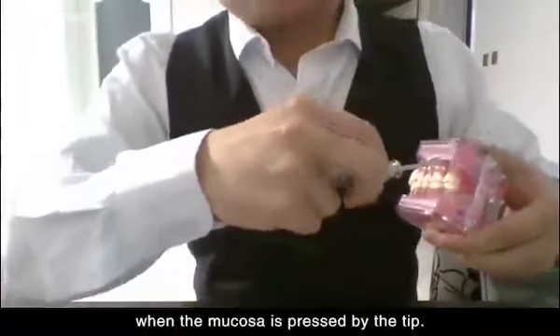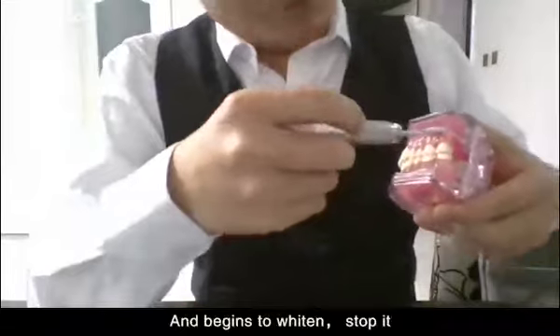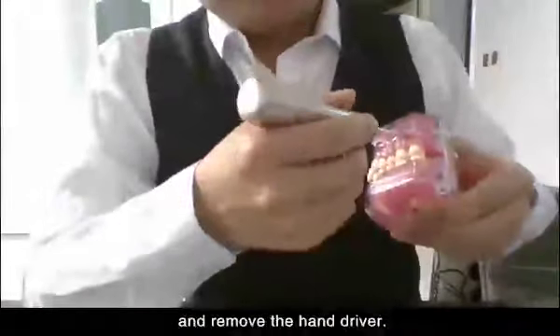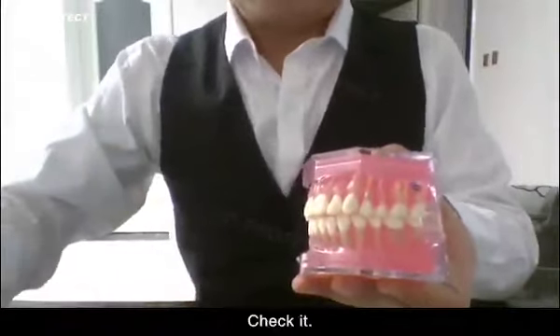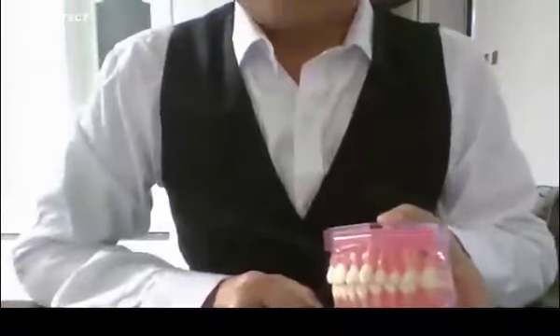When the mucosa is pressed by the tip and begins to whiten, stop it and remove the hand driver. It's okay. Check it with a probe.